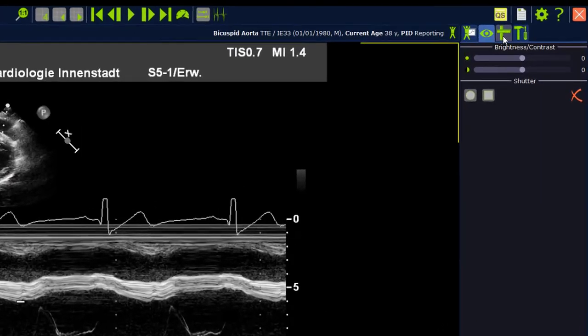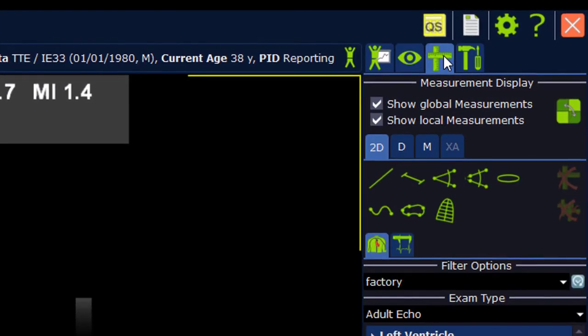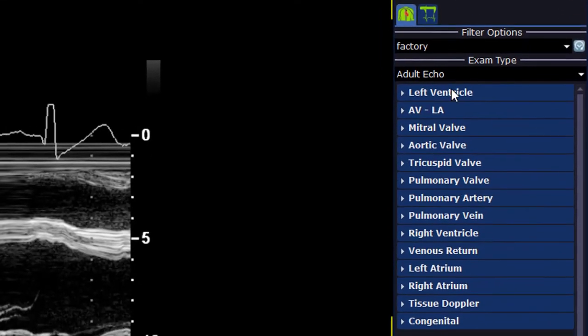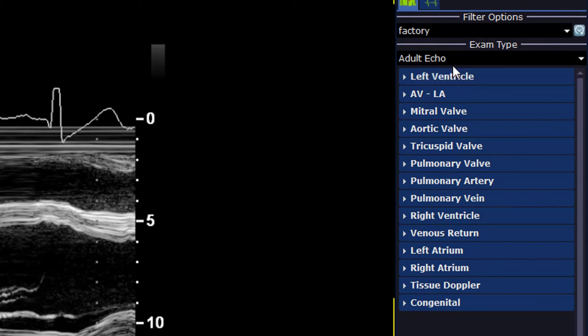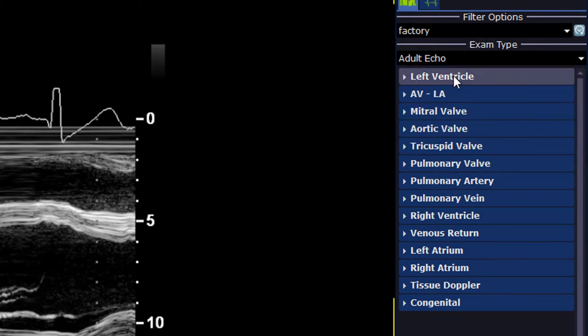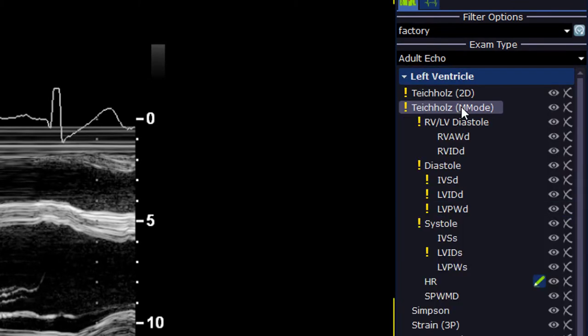To perform measurements, switch to the measurement tab on the right upper hand corner. Select the exam type echo, select the group left ventricle, followed by the package Teicholz-M-Mode.